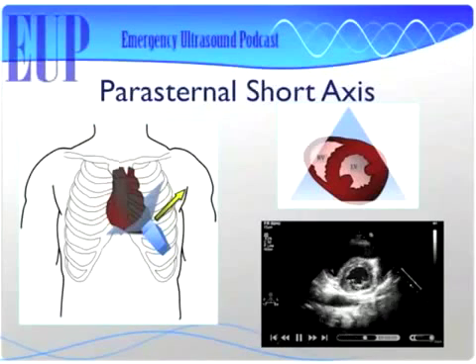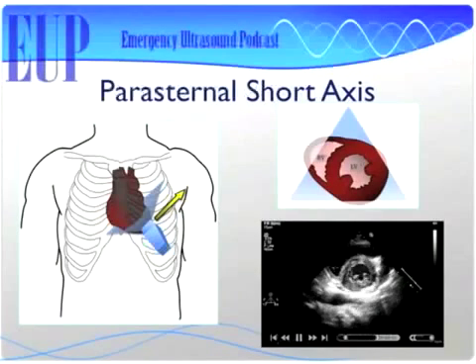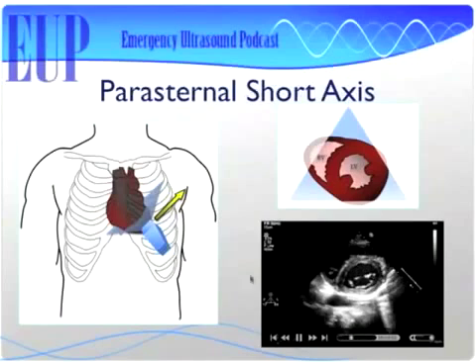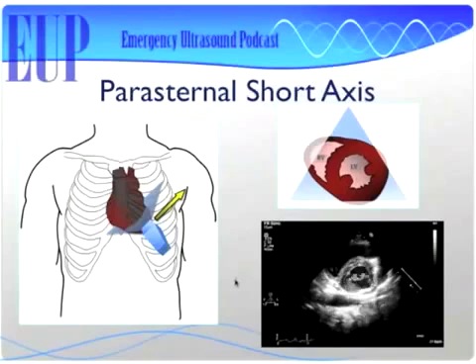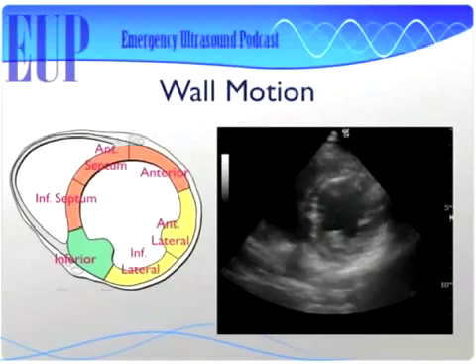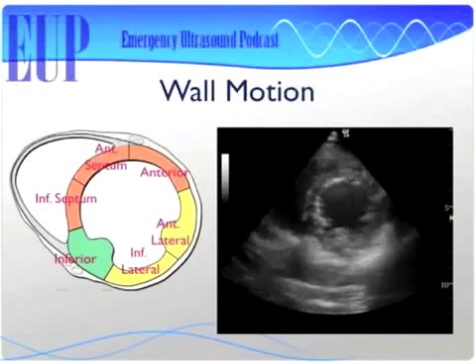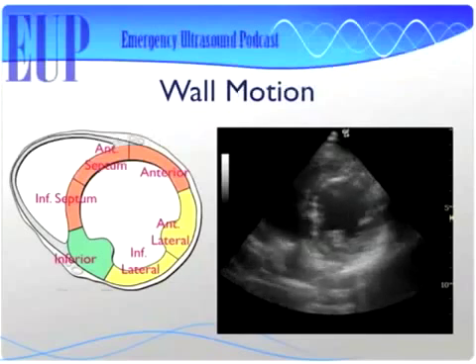About sometimes. And this shows good squeezing of that left ventricle. Everything's squeezing toward a central point, which you would expect, and the muscle itself is actually thickening during systole, which is what we're really looking for, the thickening of the muscle, even more than the movement itself. So we can break that short axis into different segments, and this is what we mean by segments when we say segmental wall motion abnormalities.